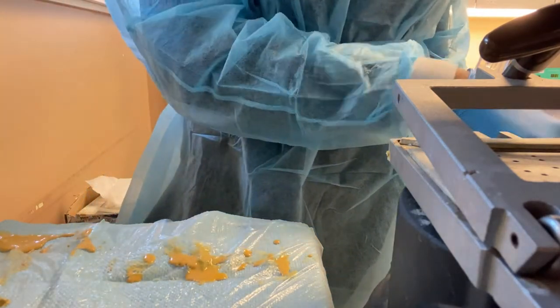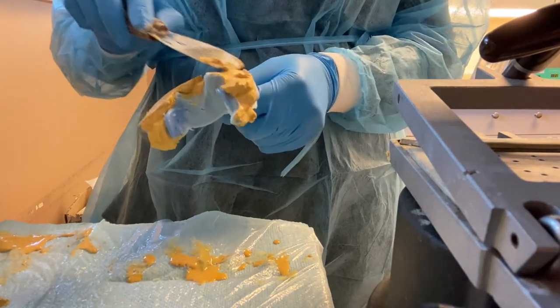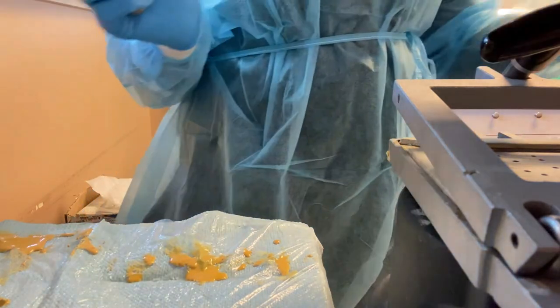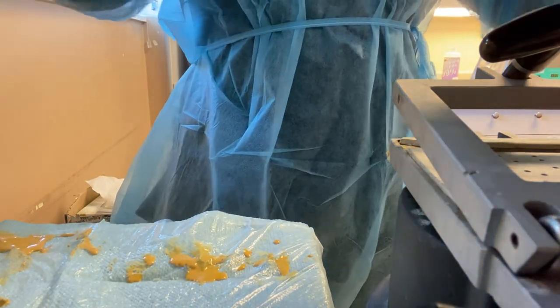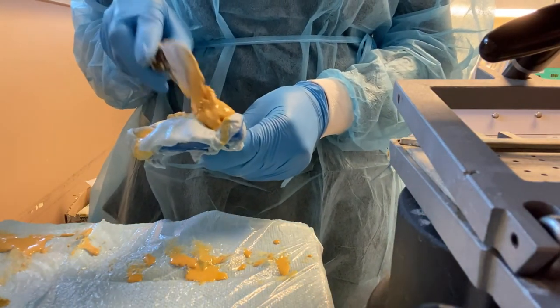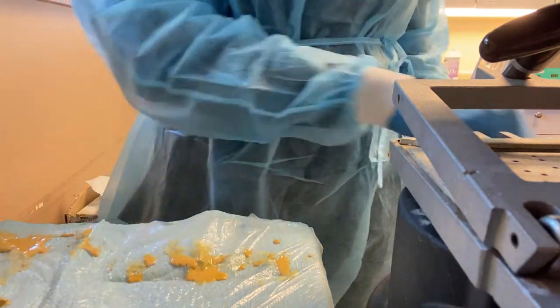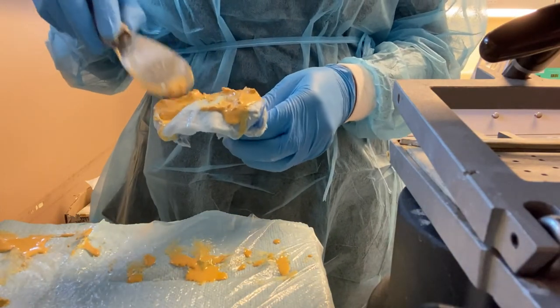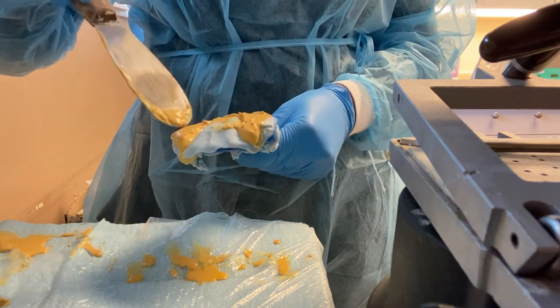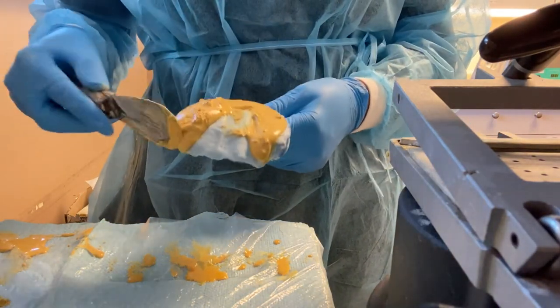Also, when you guys are packing on the stone for the base, make sure you don't get it interlocked with the tray. A lot of times we make the mistake, or sometimes the base is too runny that it goes into the tray part. If it sticks to the tray, you're going to have a hard time pulling that impression out. So what I do is keep it on top of the alginate or whatever material you use to take the impression. Never really go beyond the tray, because trying to pull it out will either break it or mess up the model. And you would hate for the patient to have left already and then you have to call them back to take a new impression.